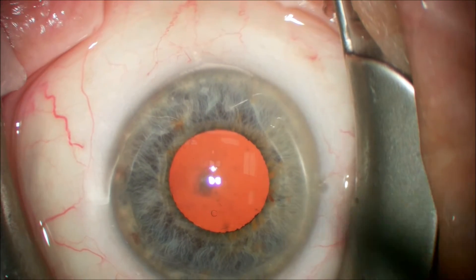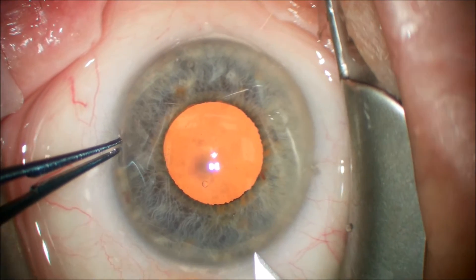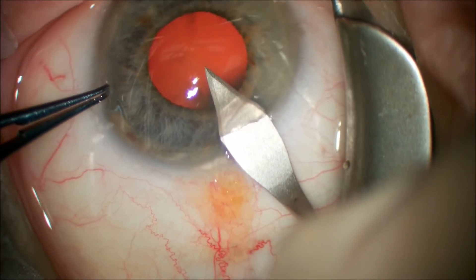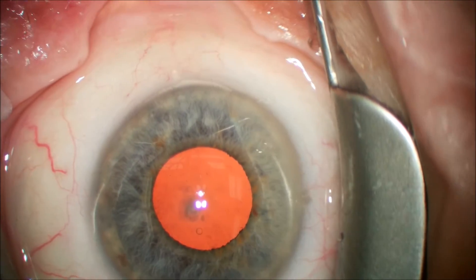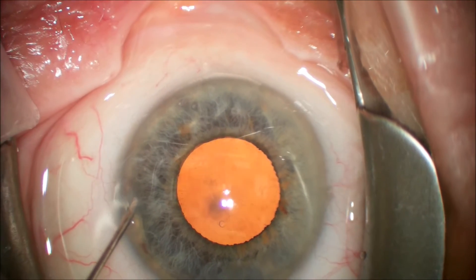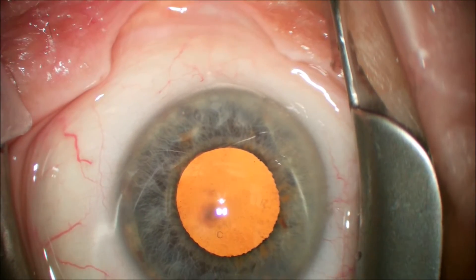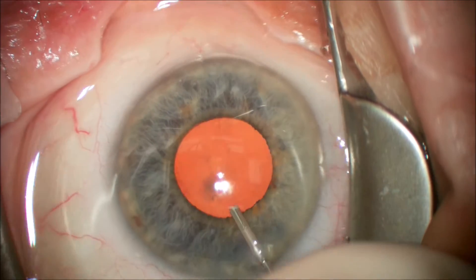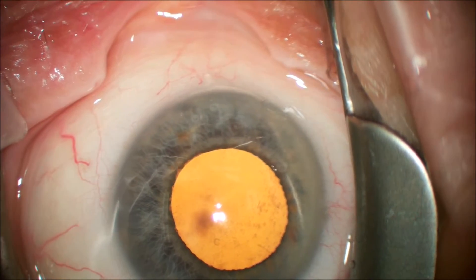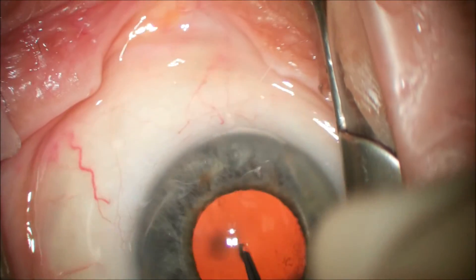You can see the pupil does not dilate more than 4 millimeters and we make our usual side port incision and 2.8 millimeter clear cornea incision temporally. We then inject phenylephrine into the anterior chamber using a 27 gauge cannula to see if we can achieve some pupillary mydriasis not obtained with the topical medications. After the phenylephrine has been in the anterior chamber for approximately 10 seconds, we inject a dispersive viscoelastic. You can see that we've got approximately another 1 to 2 millimeters of pupillary dilation.